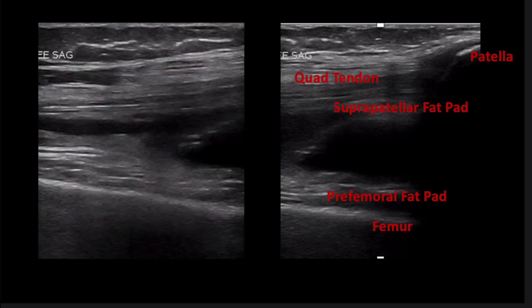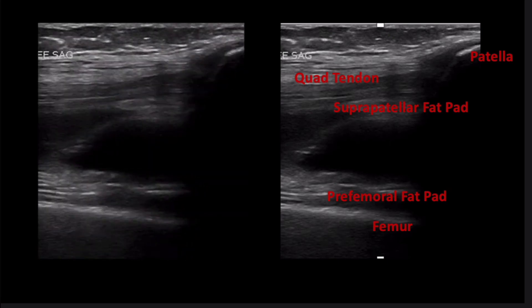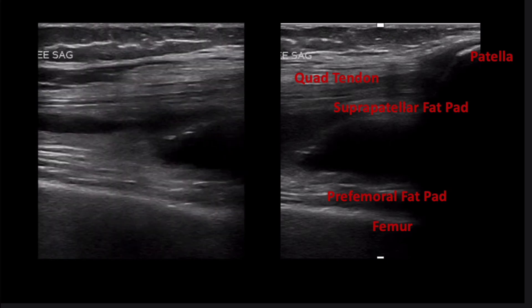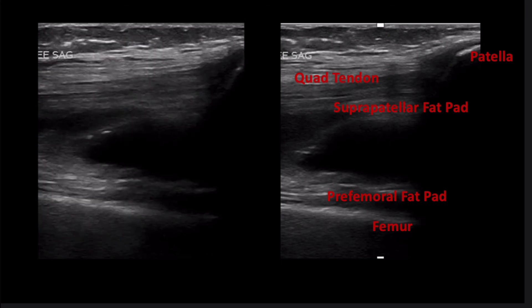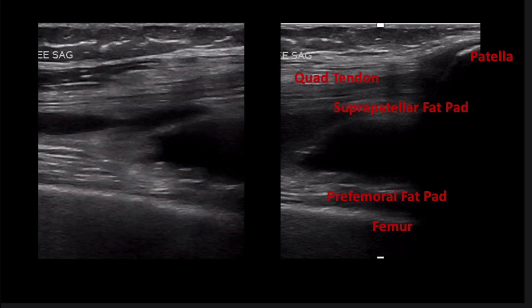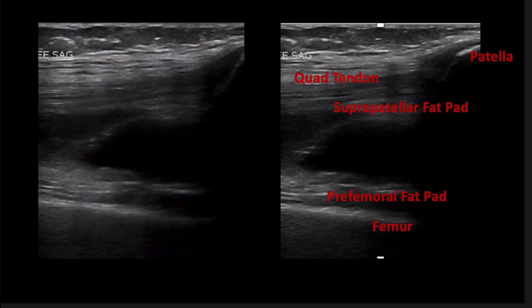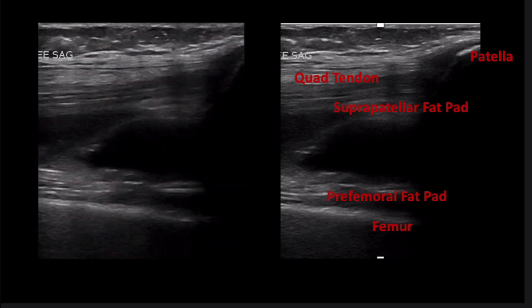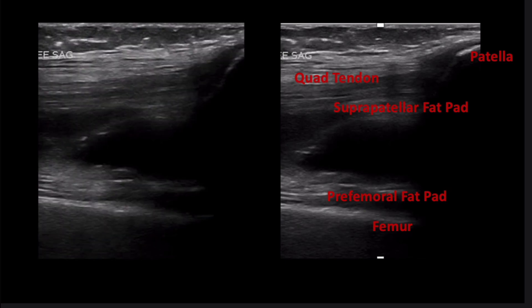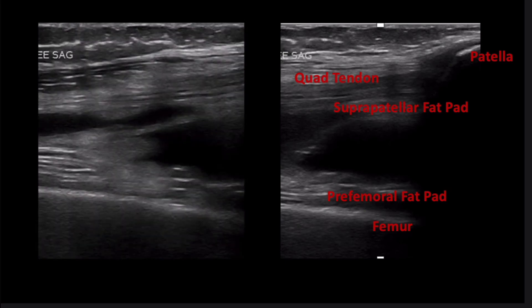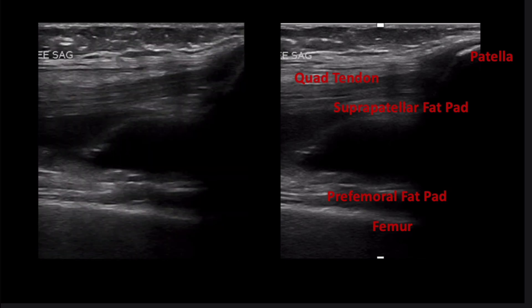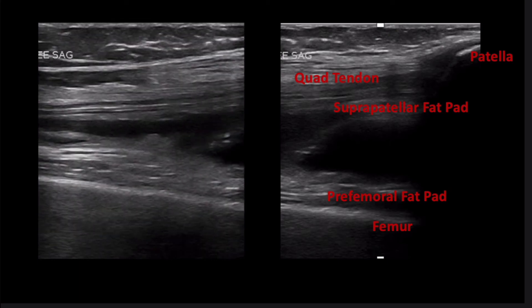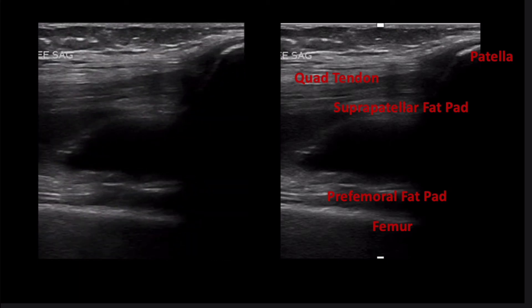As a final refresher of knee anatomy, I wanted to give this example of a knee with a joint effusion yet no other pathology. The patella and femur are shown along with the quadriceps tendon, which you should now feel comfortable identifying. Both the suprapatellar fat pad and the pre-femoral fat pad are shown, with a moderate-sized joint effusion present in the suprapatellar recess.